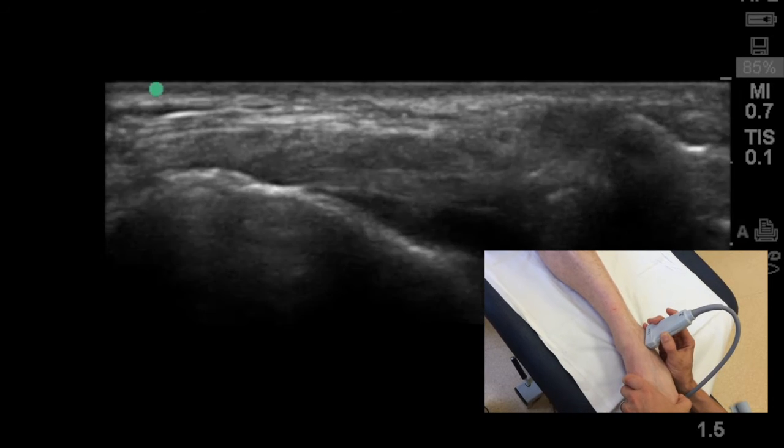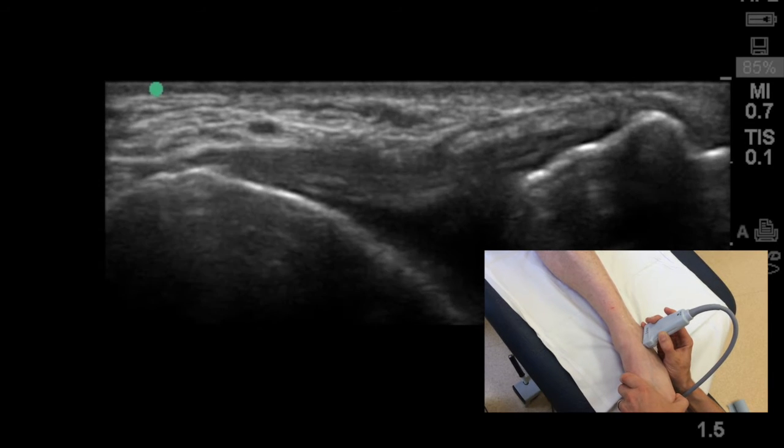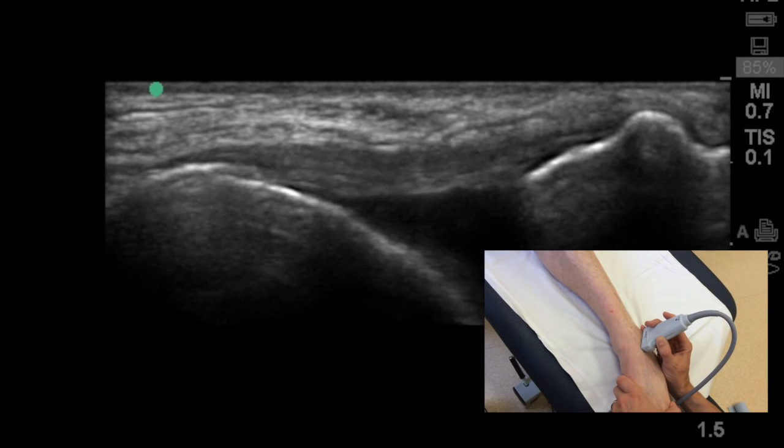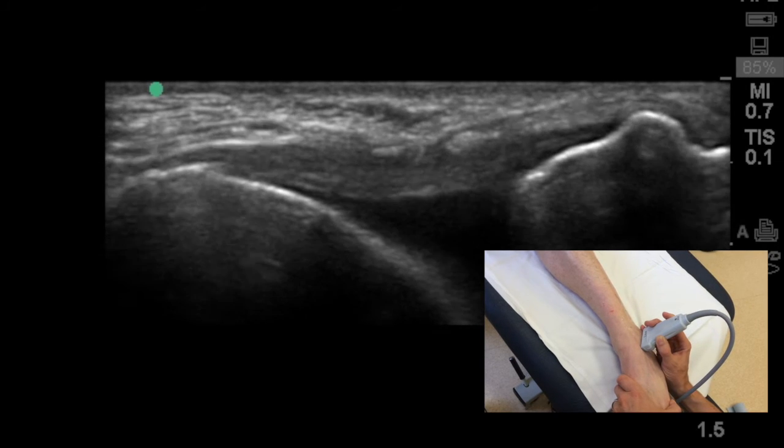You can further confirm that to yourself by applying a slight stress test to the ligament into plantar flexion and inversion, highlighting the hypoechoic band of tissue between the talus and the fibula.